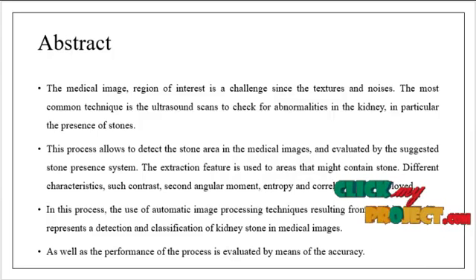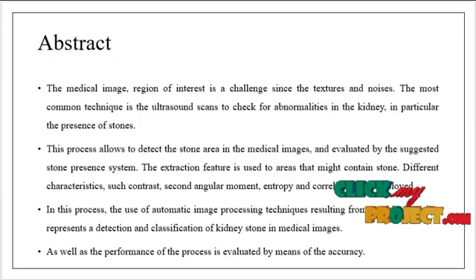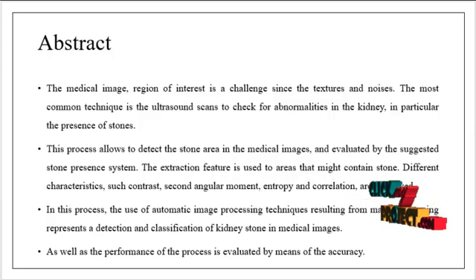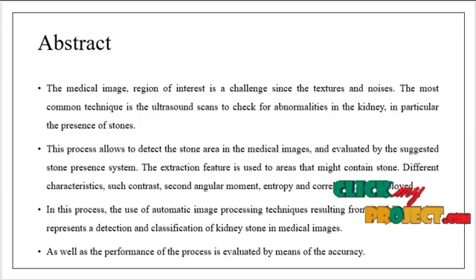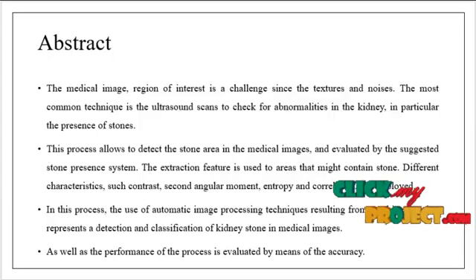the accuracy. The major part of this project is to detect kidney stones at an earlier stage, and non-kidney-stone cases will also be classified. As the accuracy is improved, the classification rate is improved.